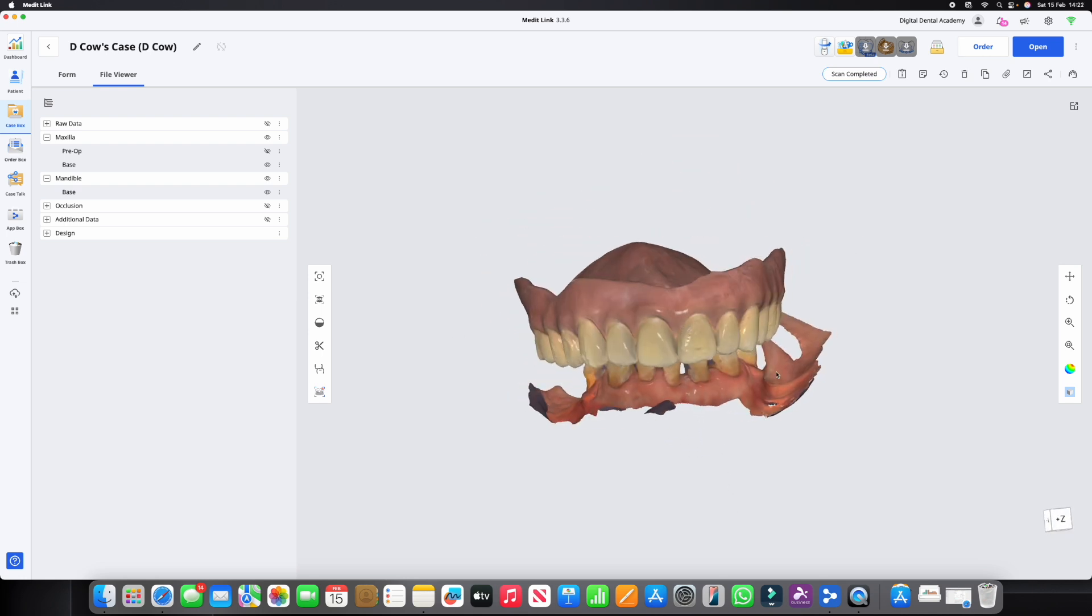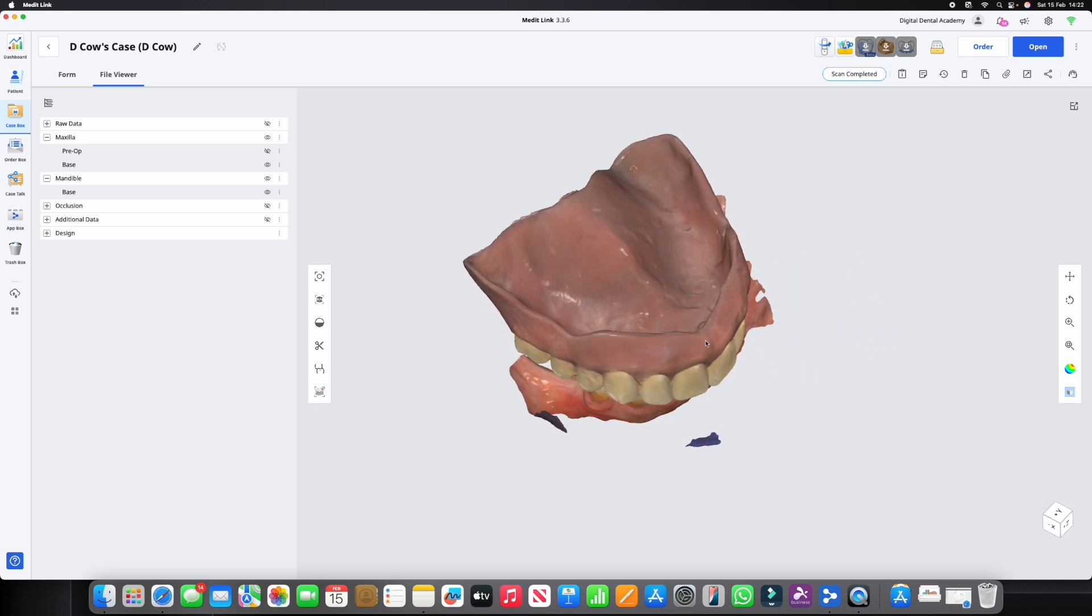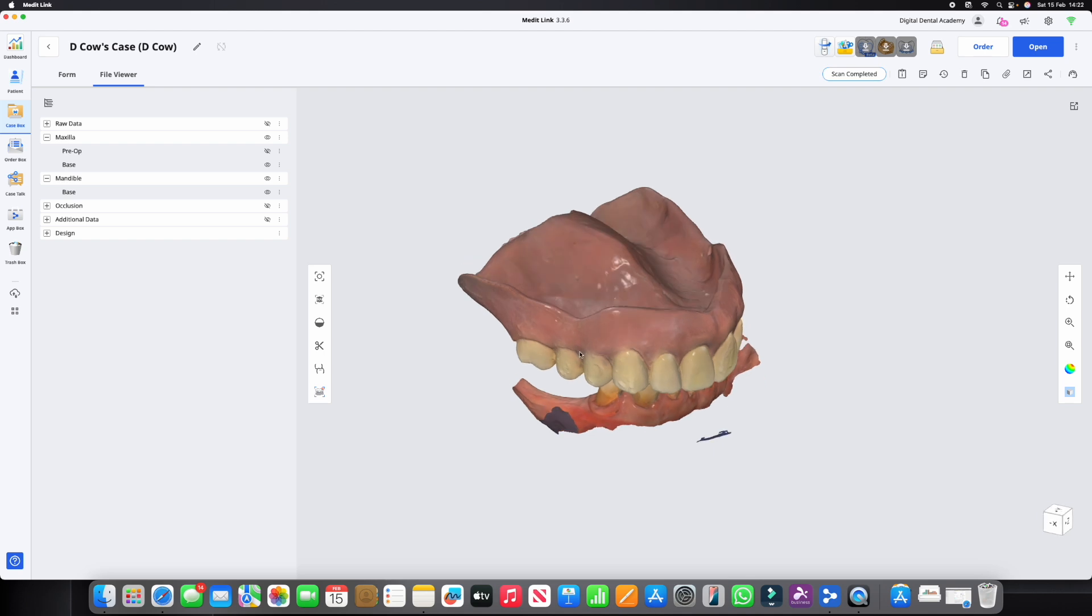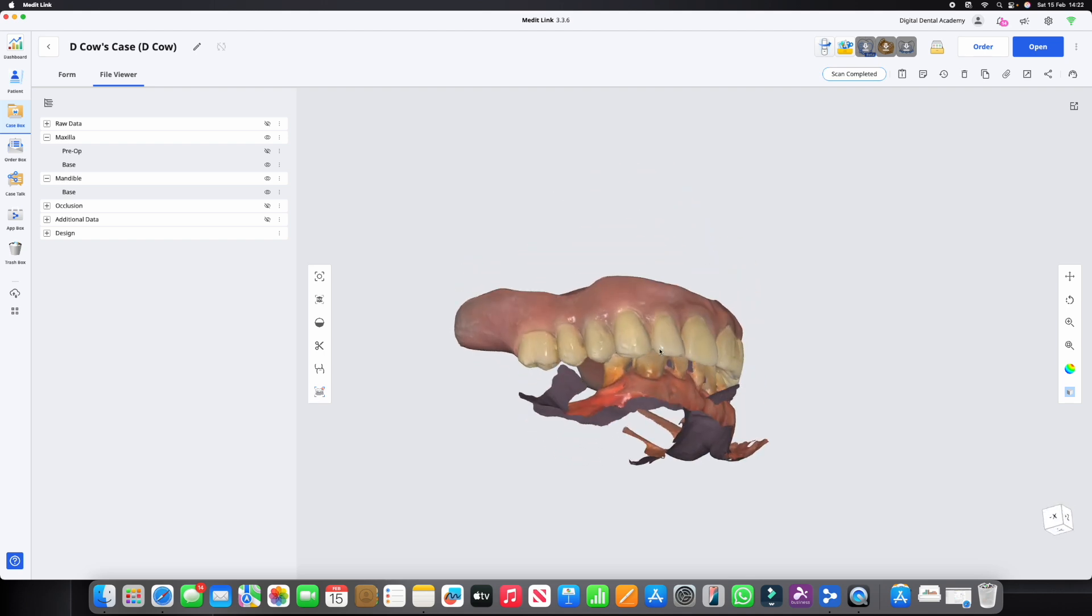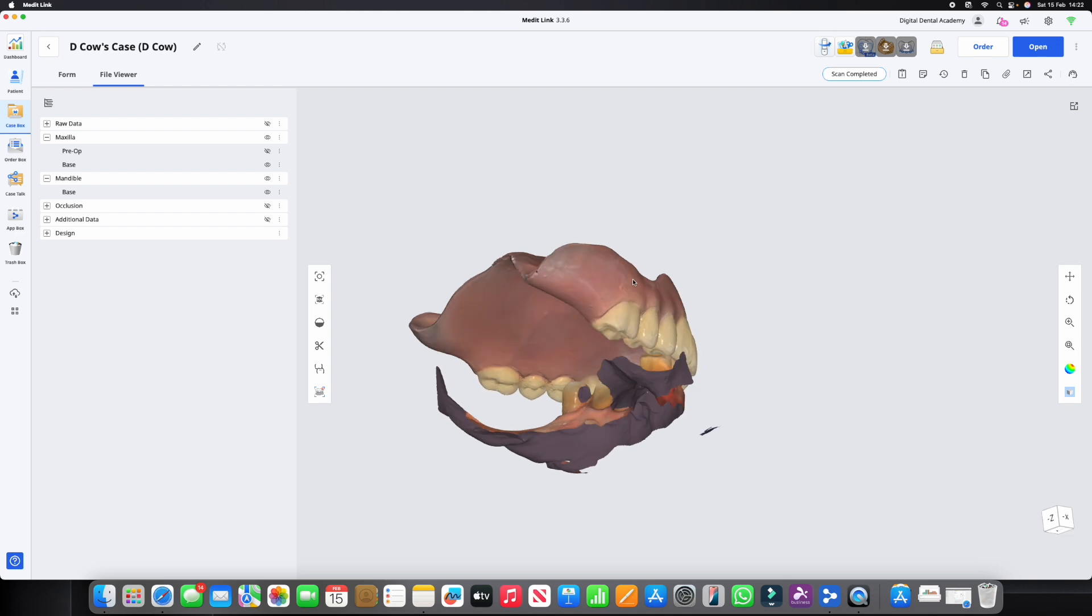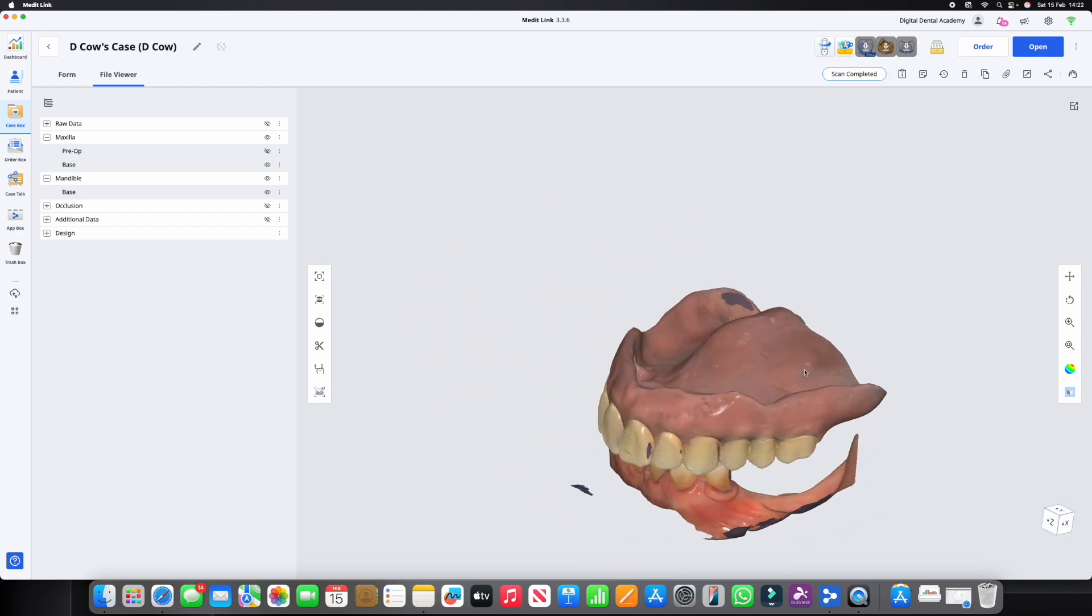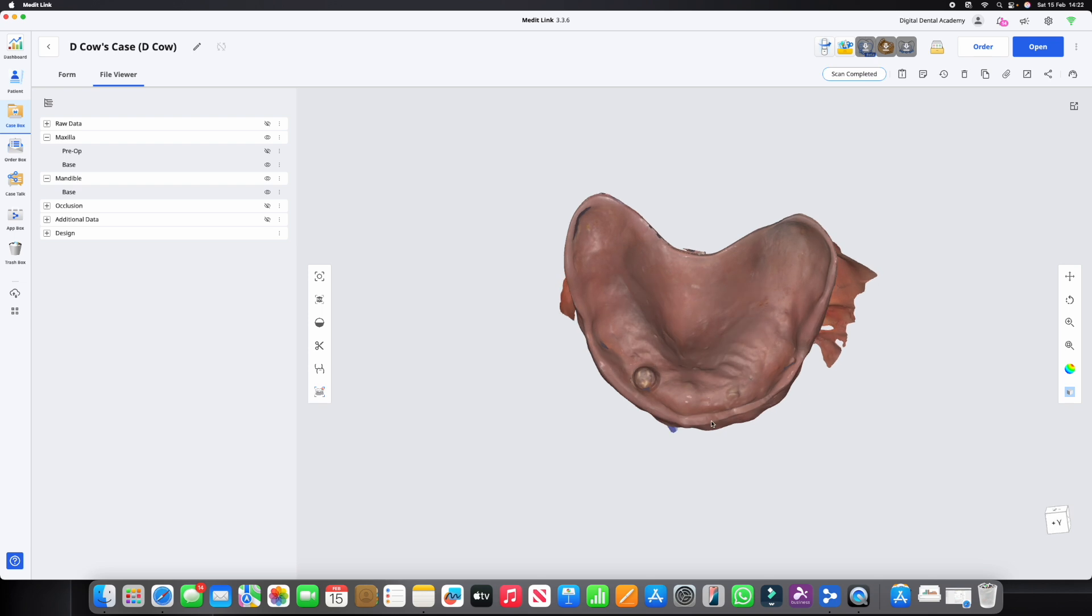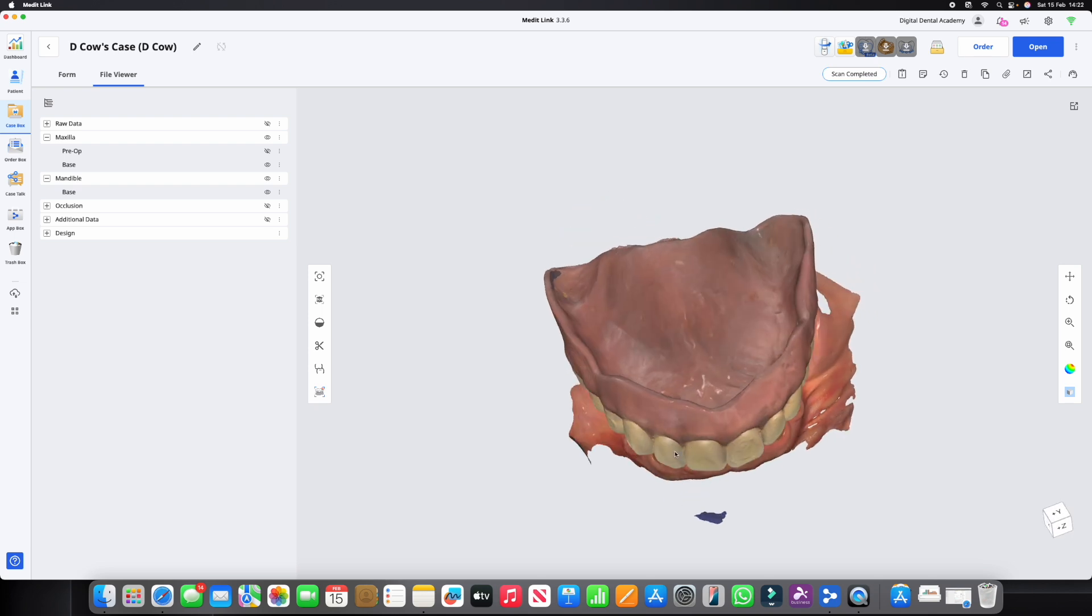What I've done is in the upper scan I've scanned that denture in its entirety, so around the sides, over the palatal side, and also on the fitting surface here. You can see there's a couple of little miss bits but that doesn't really matter for the purposes of what I'm going to show you.